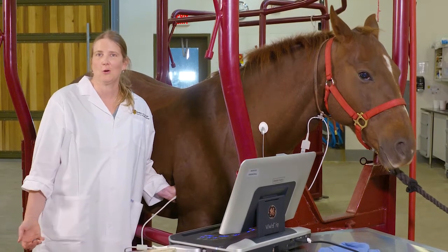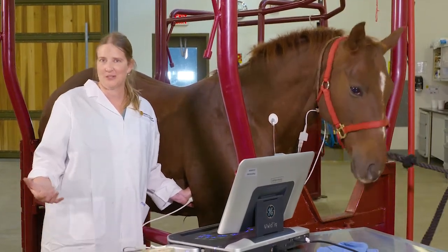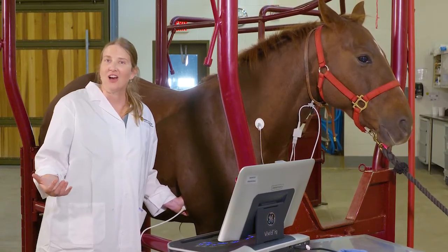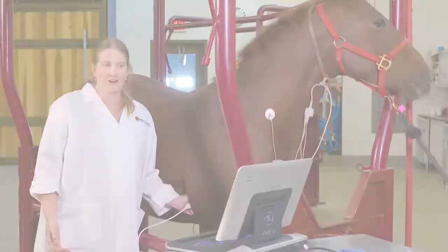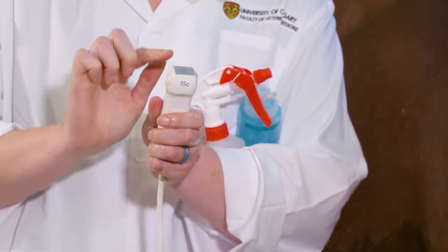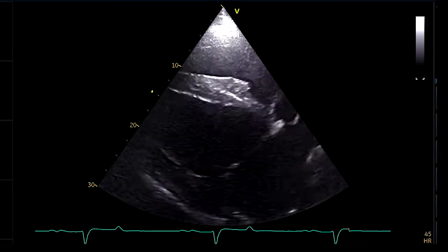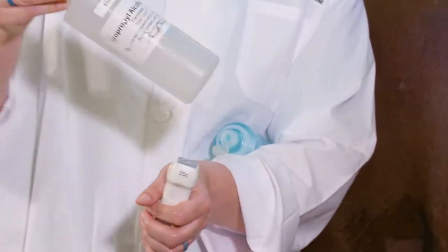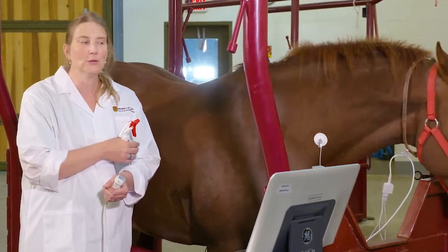What we're doing now is called an echocardiogram. Breaking that word down: 'gram' means doing some kind of testing procedure; 'echo' refers to echolocation, using sound waves; and 'cardio' is heart. So we're doing a test using sound waves on the heart. This is our cardiac probe — it has a little square end which sends out sound waves in a very specific way, essentially giving a triangle or pie-shaped view, allowing us to go quite deep in the chest to look at the horse. We use gel, just like in humans, as well as some alcohol, because the horse has hair. We've clipped an area on Daryl here to help with that.